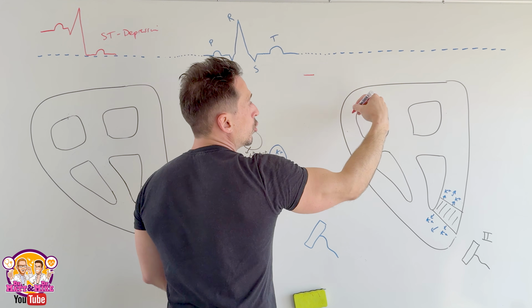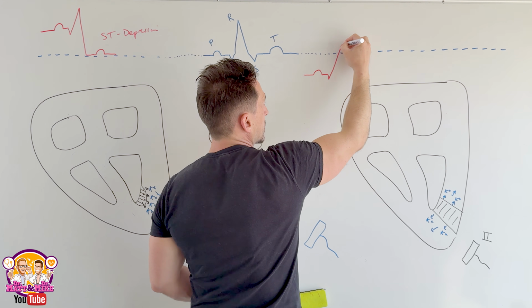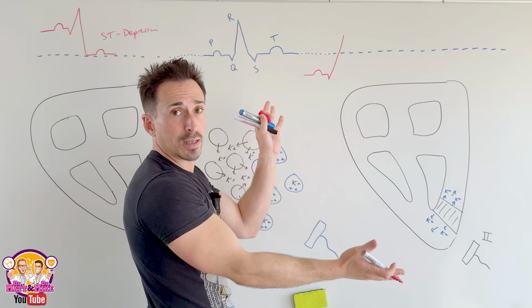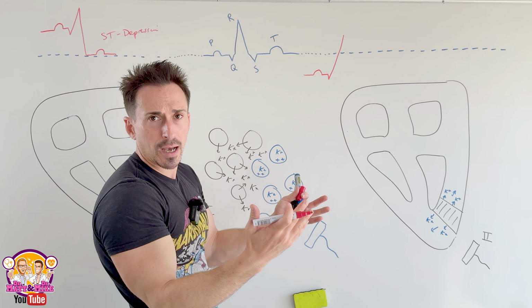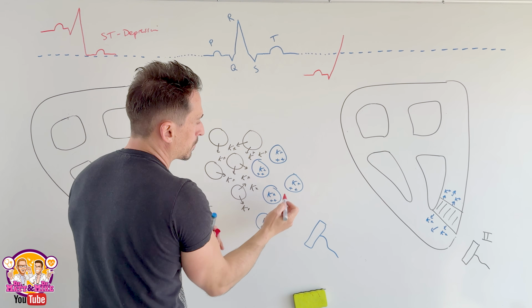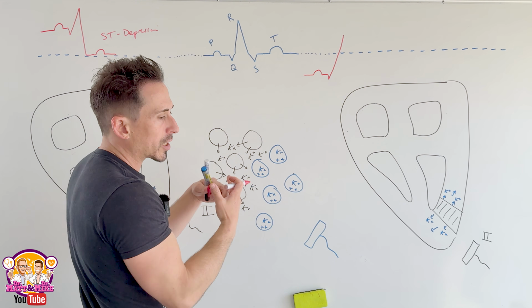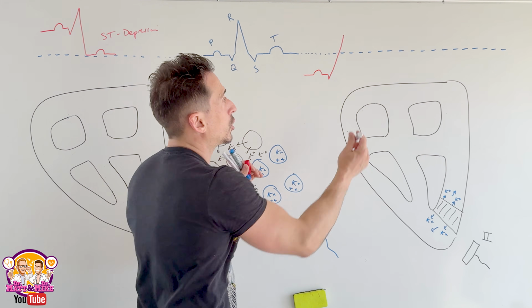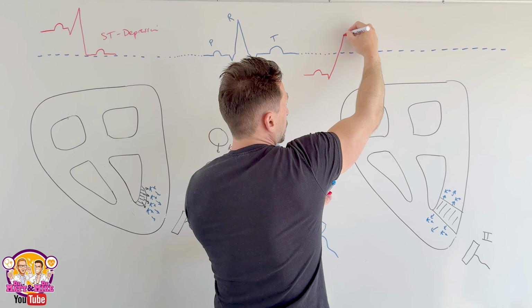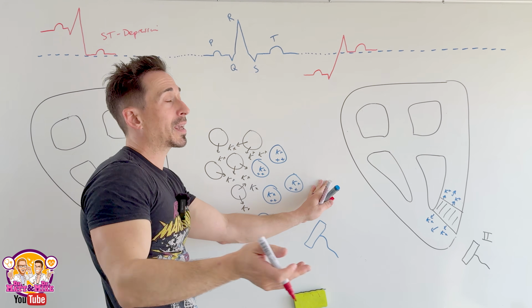And then you have a normal atrial depolarization, and then ventricular depolarization. And then once the whole thing's depolarized, there's no electrical charge difference to pick up, because everything's depolarized. Remember, in the beginning, the baseline was different because these ones depolarized early. But once everything's depolarized, it's just like a normal ECG now. So it can go back to its normal baseline. And then that's why you have your ST segment elevated. And then the whole thing happens again.